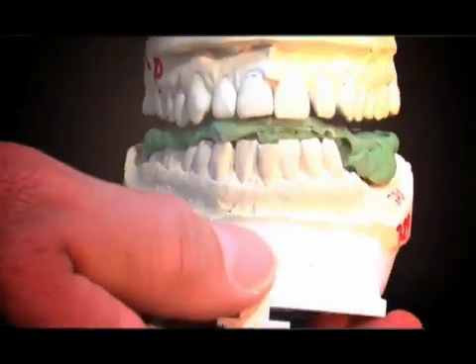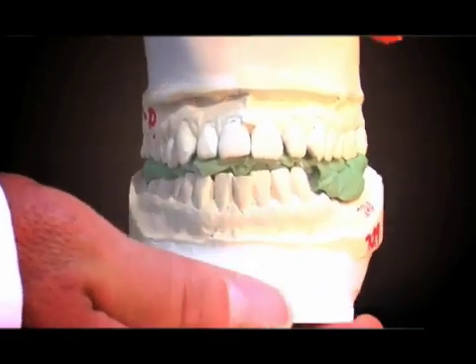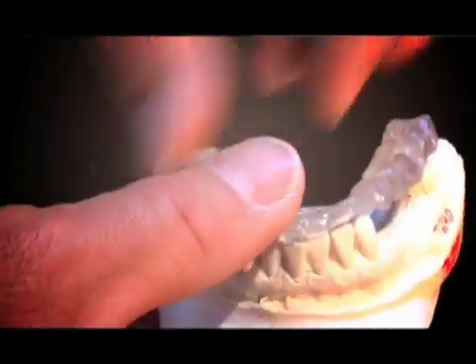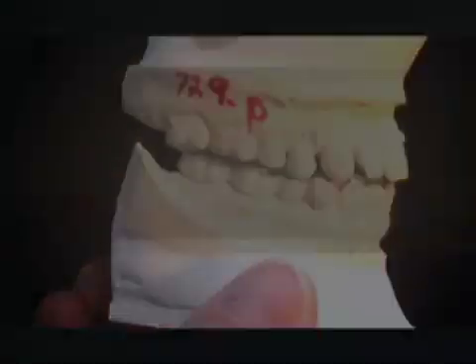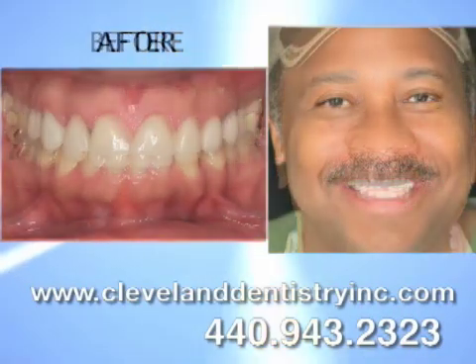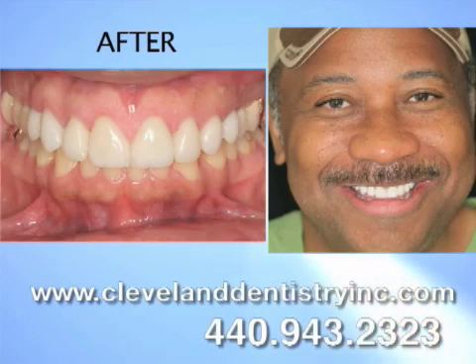After we've been able to achieve that, then we go ahead and refabricate what's called an orthotic, which is a piece of plastic that basically just sits on the lower jaw and positions that mandible to a more physiologic environment. A lot of times, after we put these patients through these neuromuscular workups, they feel pretty good. Their headaches, they've gone away. They don't have the TMJ discomfort like they did before.